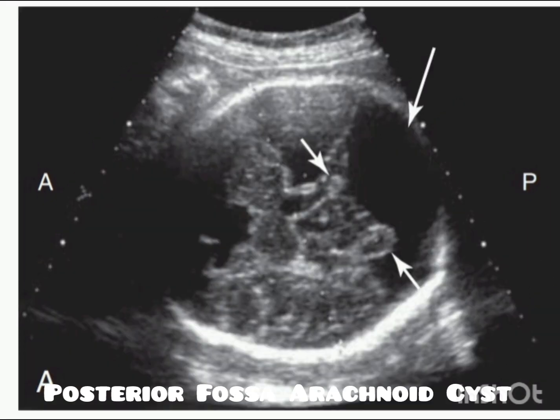In this image, you can see another example of a posterior fossa arachnoid cyst. There is a large fluid collection in the posterior fossa indicated by the long arrow, which is displacing and compressing the cerebellum indicated by the short arrow. There is no cerebellar splaying and the cerebellar vermis is intact.